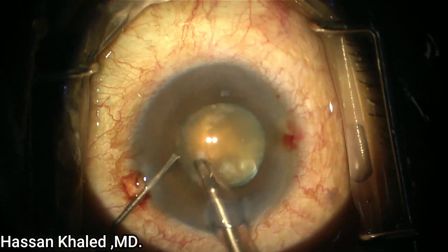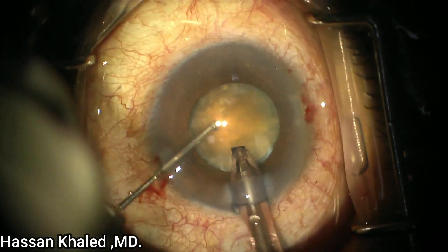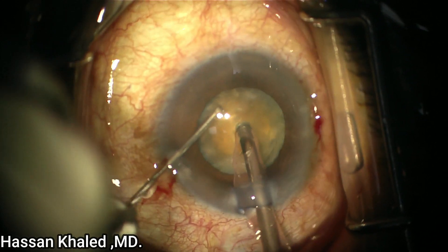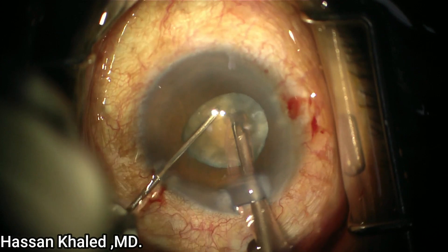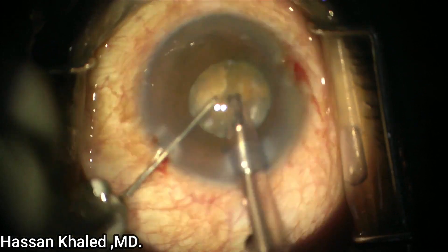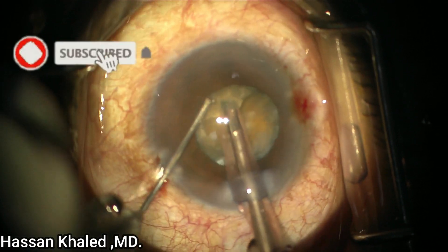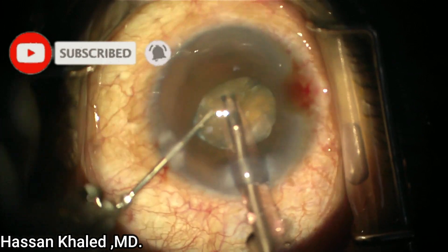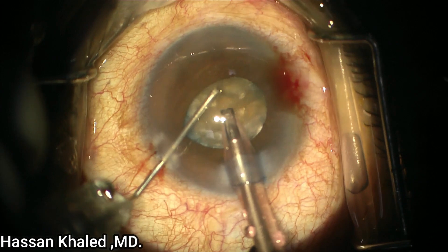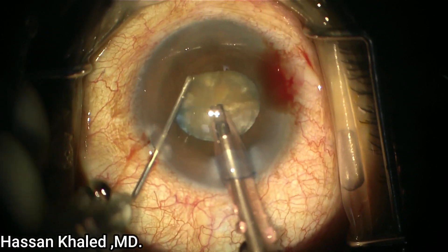Here is the vertical chopper that I prefer to use in dense cataract, using a 27-gauge needle. Now shaving the epinucleus, then I embed the phaco probe in this dense nucleus, then do a vertical chop. But you can see there is no complete separation with this movement. I hold again the other part and do a vertical chopping of this dense cataract — I think the separation wasn't completed.